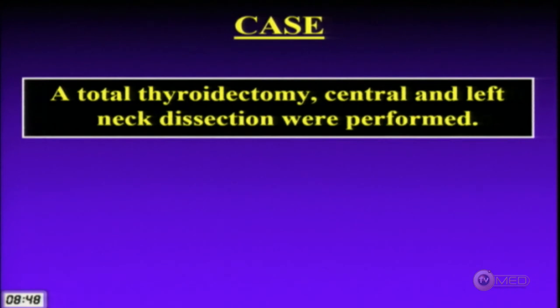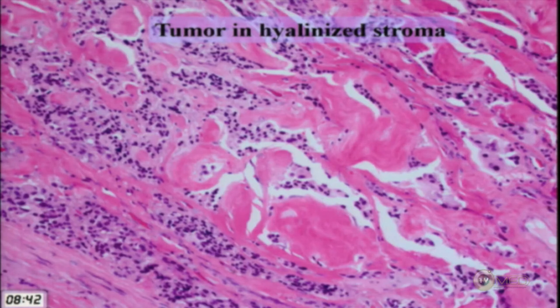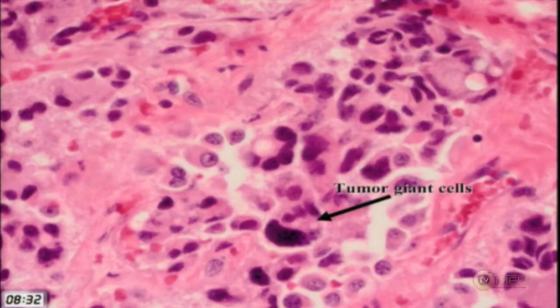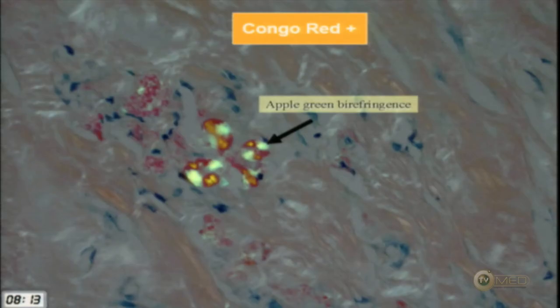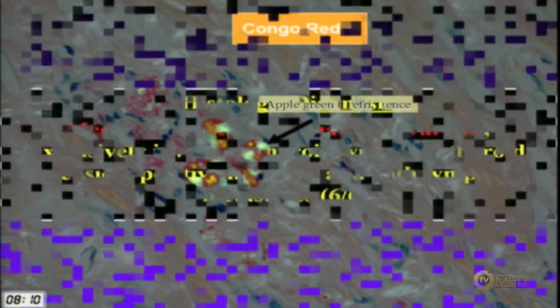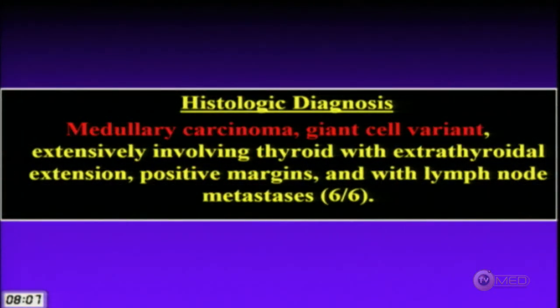After a total of 19 months, the tumor was deemed surgically resectable — not behaving like anaplastic carcinoma. The patient had a total thyroidectomy and central and left neck dissection. Histology shows loosely cohesive tumor cells in dense hyaline stroma. High power reveals bizarre tumor giant cells and ring cells with a plasmacytoid look. Calcitonin stain was very strongly positive, and Congo red showed apple-green birefringence.